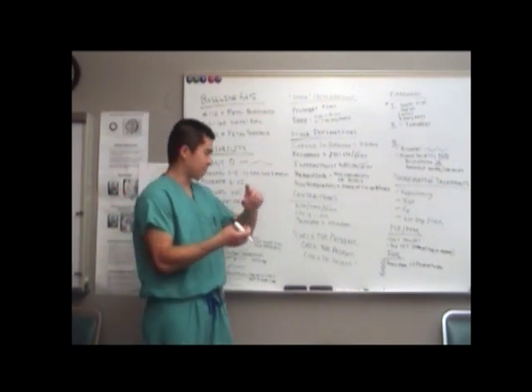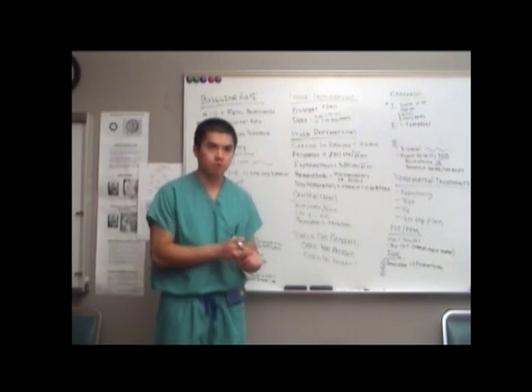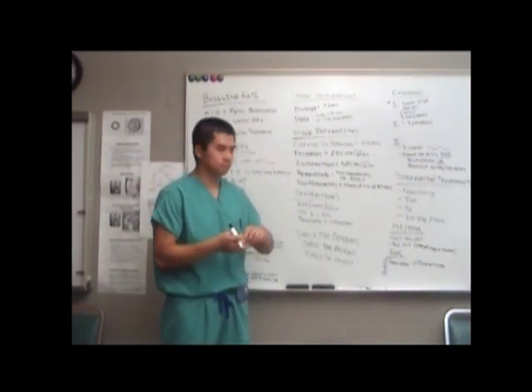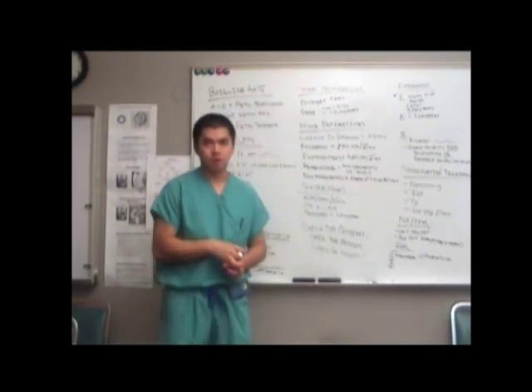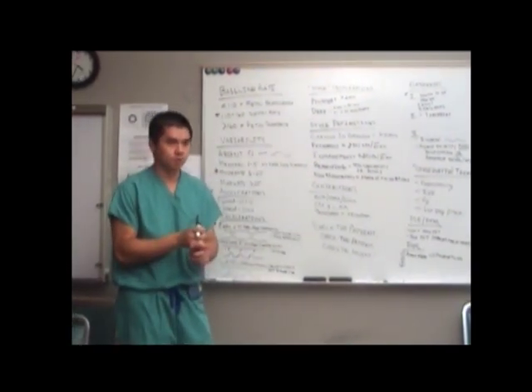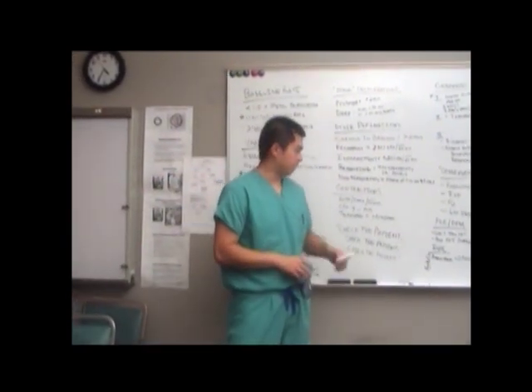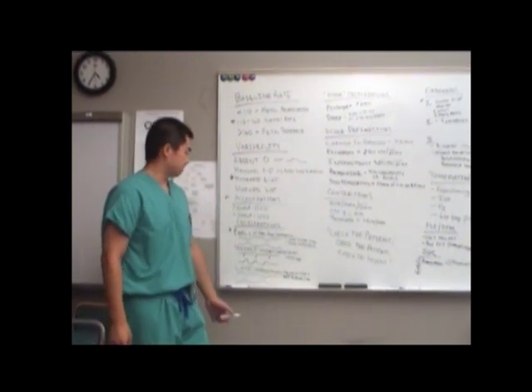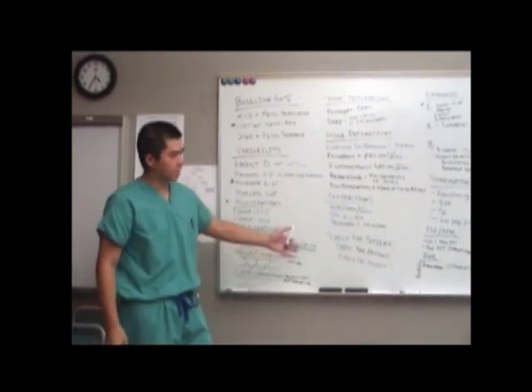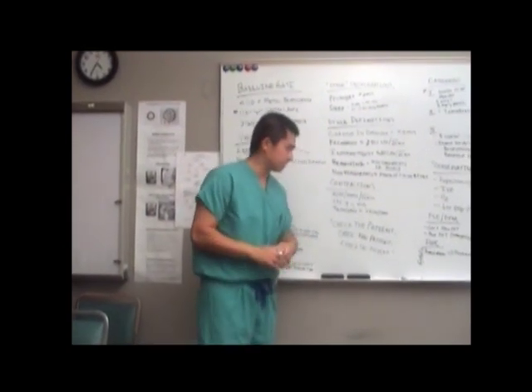It's also not for recurrent lates, although you'll see some attendings do it for recurrent lates, and you'll also see some attendings do it for thick meconium. But it's not indicated or proven to be of any benefit for that. It has been shown to be a benefit for recurrent variables, which is due to cord compression. And if you think about what's causing it, how it works, it makes sense, which most things should in medicine when you're doing things.